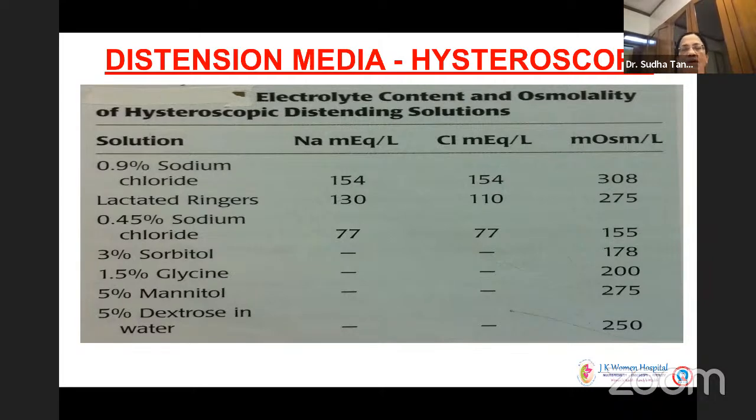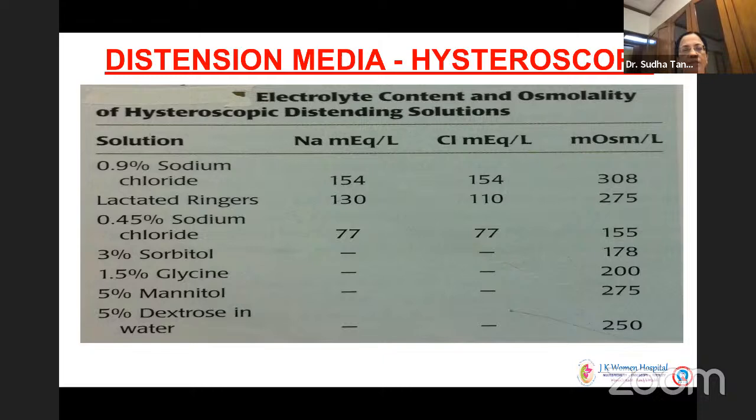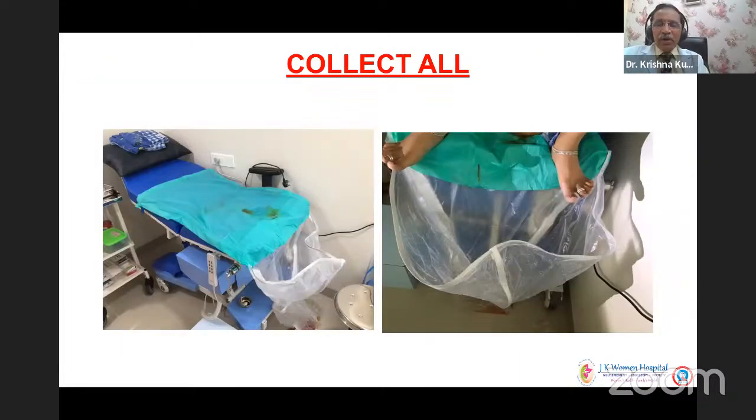And what Amrita was highlighting, anesthetists should be aware, when you exceed something, to give a dose of diuretic as well. Collectively, for distension media, I think there is no controversy today. Saline or ringer lactate should be the media of choice for whatever you do, right? Right, sir.